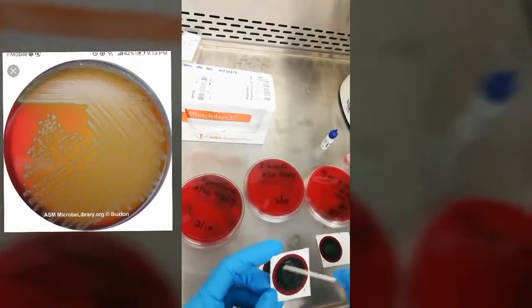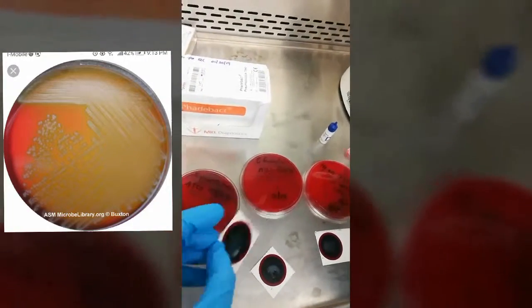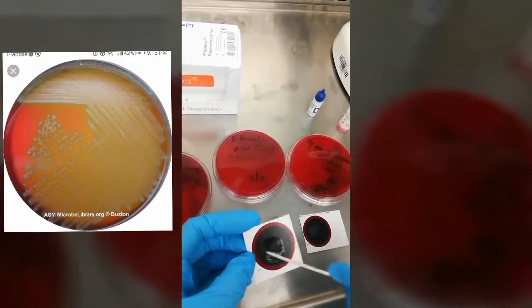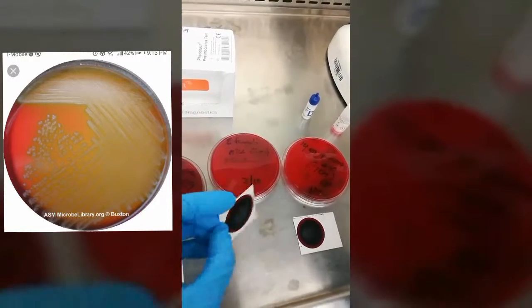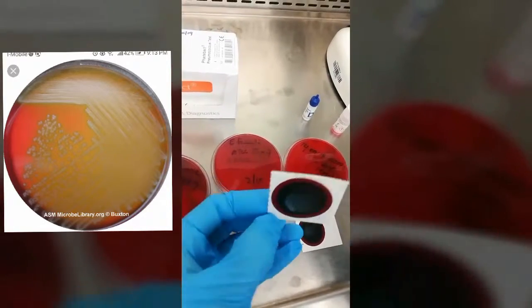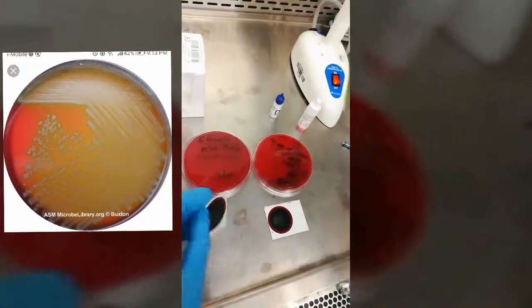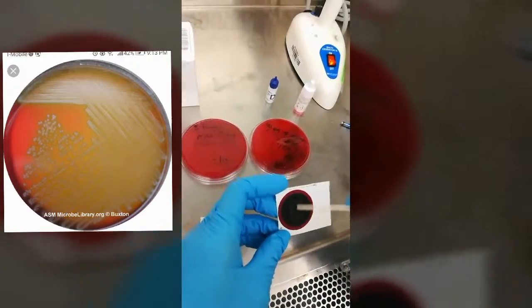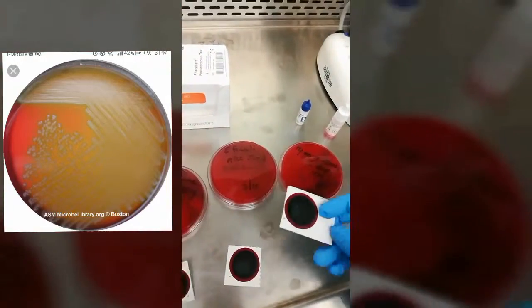For Enterococcus species, group D, PYR needs to be positive. Streptococcus group D test is positive. Pneumoslide test is negative. Catalase test is always negative.